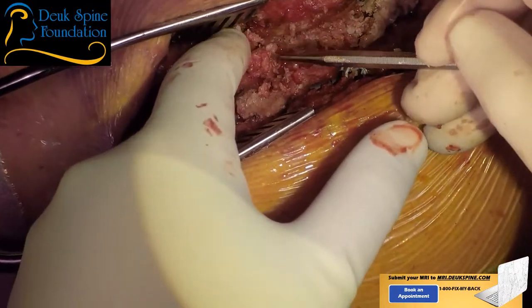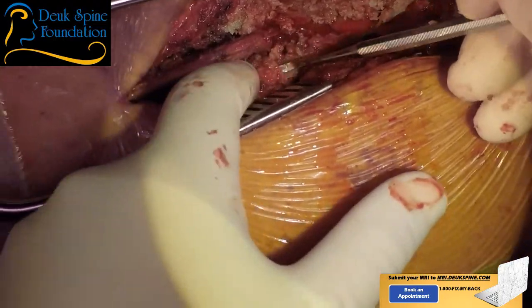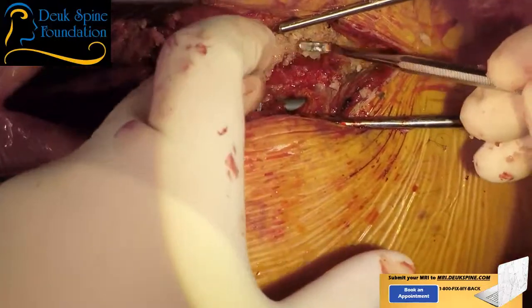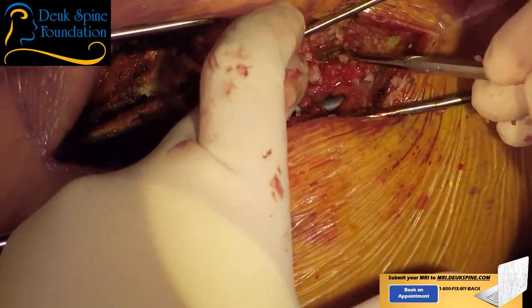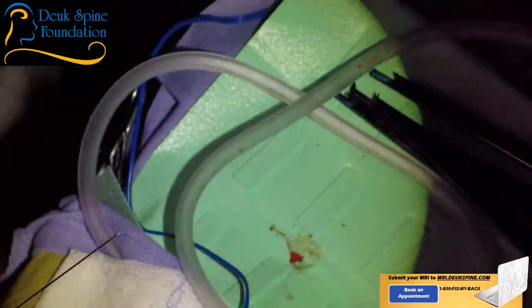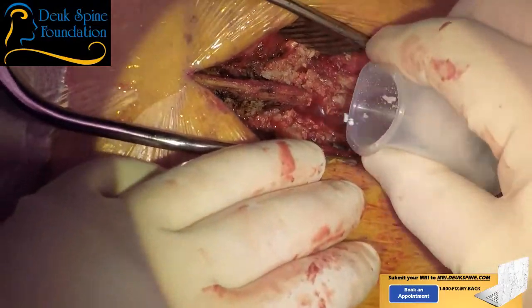You don't want your bone graft crushing your spinal cord, so I don't trust this piece, it's too chunky. Yeah, Vanc. I need just half a gram. So bone graft in the lateral gutter. Keep the blood pressure around 90, 100. This is half a gram? Half a gram, good.